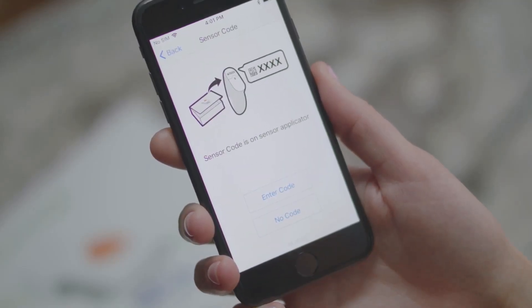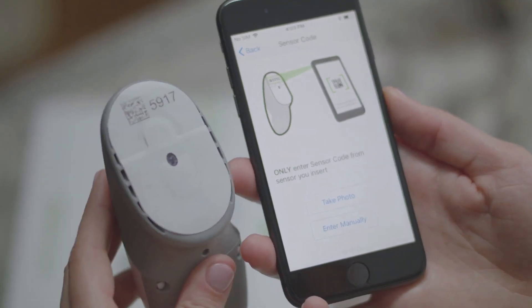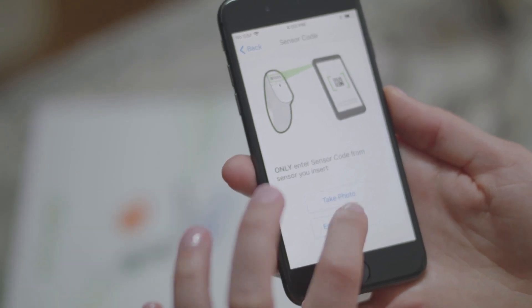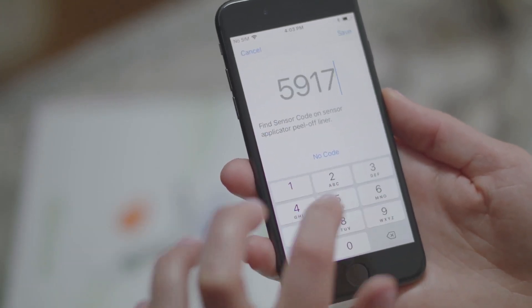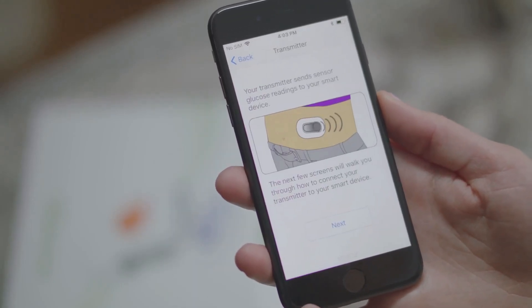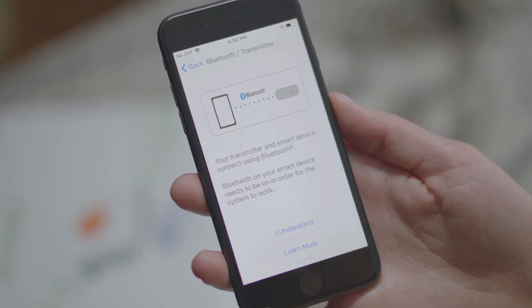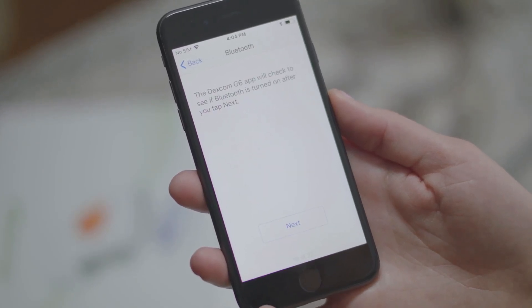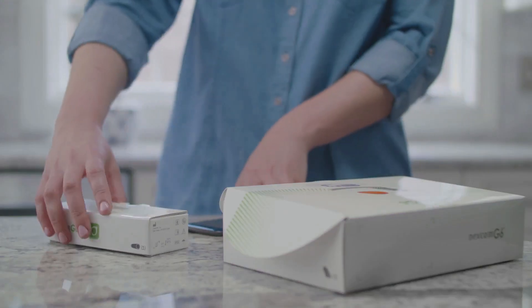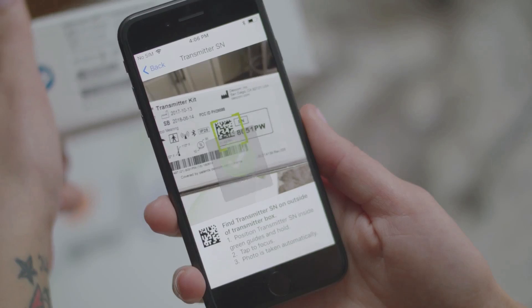Next, I need to enter a sensor code. My sensor code is on the sensor applicator. The next few screens walk you through connecting your transmitter to your smart device. Your transmitter and smart device connect using Bluetooth. The app automatically checks to see if your Bluetooth is on. Next, you need to enter your transmitter serial number. The serial number is on the back of your transmitter box. That's it for app setup.